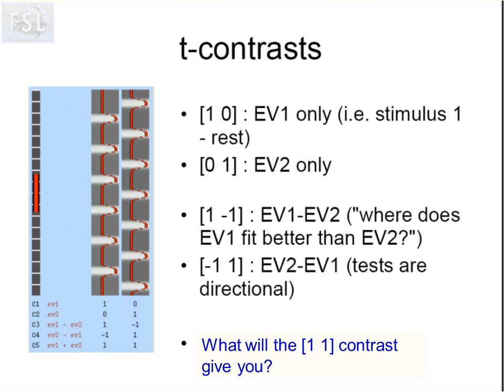Right, this slide just shows you how contrasts of parameter estimates that result in T contrasts are specified in the FSL design matrix. So this design matrix just embodies the very simple design for let's say visual stimulation is explanatory variable 1, auditory stimulation is explanatory variable 2. You can very clearly see the time course of the different experimental stimuli: stimulus off, stimulus on, off, on for visual, etc.